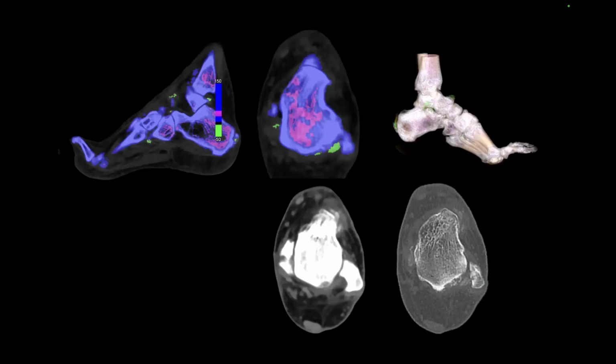What has really paved the way for gout, though, is the development of dual energy CT, which allows different spectroscopy, and in this case it's for showing up the urate crystals. This patient had extensive gout deposition, which you can see quite easily on the non-colored imaging, where there is soft tissue mineralization forming around the joints and near the capsular attachments, with erosions. But it labels up quite nicely on the dual energy with the green color in this case.